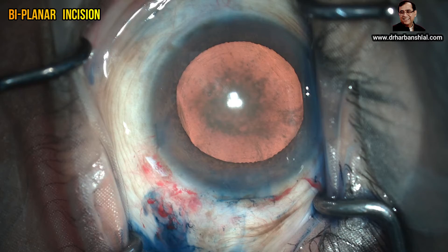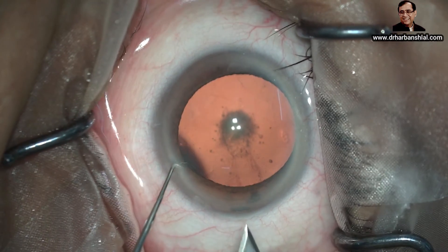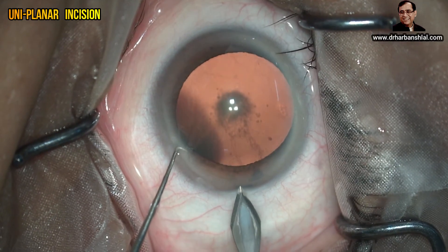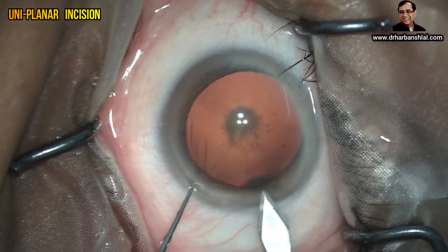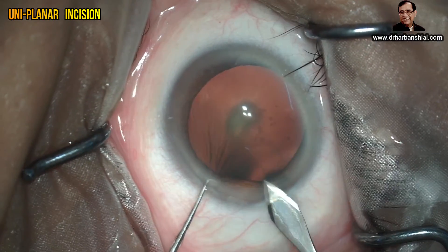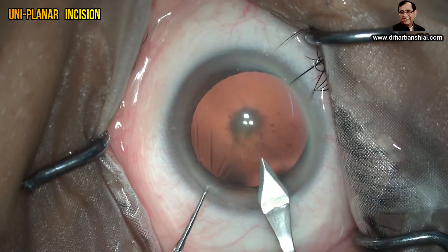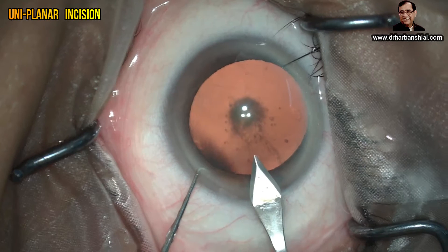Once you have mastered the biplanar tunnel, you can go on to the uniplanar tunnel. You can see a beautiful pocket has been created. The uniplanar incision is much faster, needs a sharp keratotome, and you make the pocket in one go. This tunnel is usually used by the experienced surgeon and causes the least post-op irritation, but it is difficult to make and not suited for SICS or PMMA lenses.